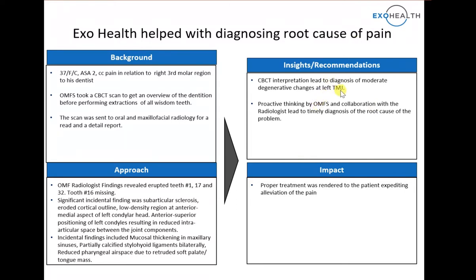the left temporomandibular joint. This is the case where the OMFS took a proactive step and led to a collaboration with the oral maxillofacial radiologist, which definitely led to the timely diagnosis of the root cause of the problem that the patient was experiencing. So the proper treatment was rendered, that is the extraction of all the third molars, and along with that the treatment of the degenerative changes in the TMJ, and that led to the alleviation of the pain, and the patient was certainly a happy patient here.